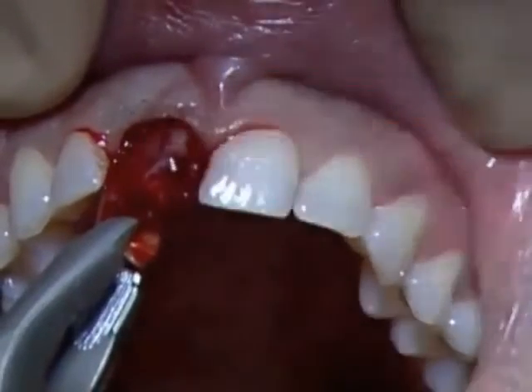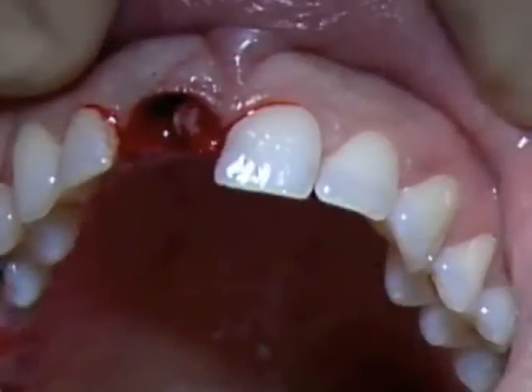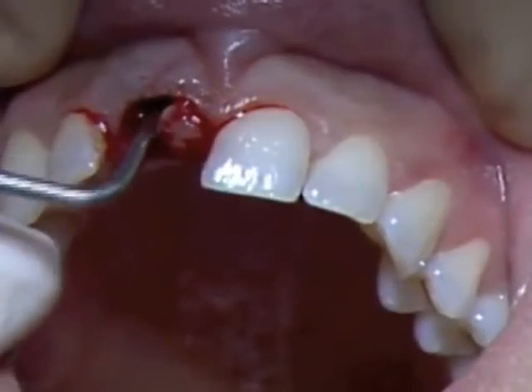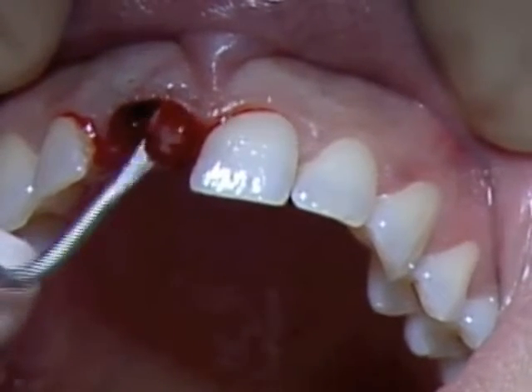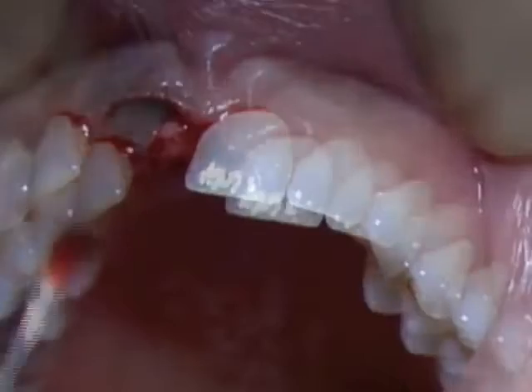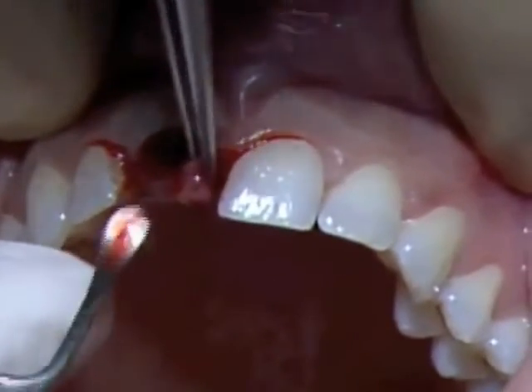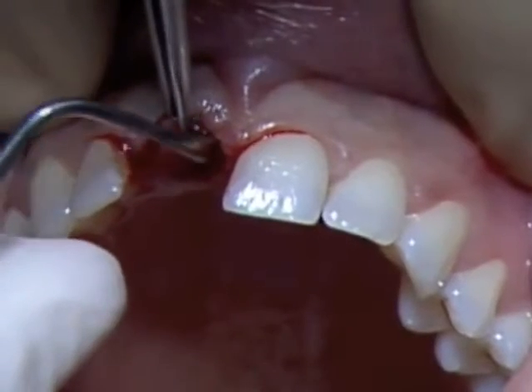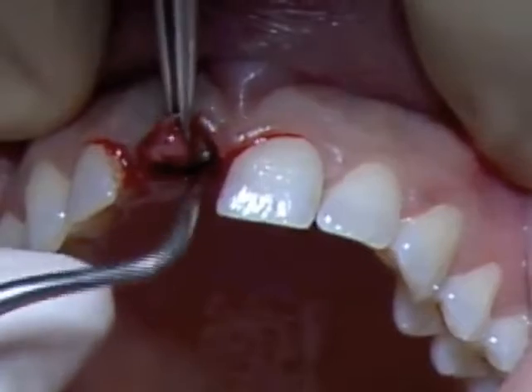It is quite big, but antibiotics prior to surgery, we know this from endodontics, help us concentrate the cyst in order to be able to remove it in one piece. We will use our curettes in order to mobilize the defect furthermore, always very cautious not to injure the mesial papilla.